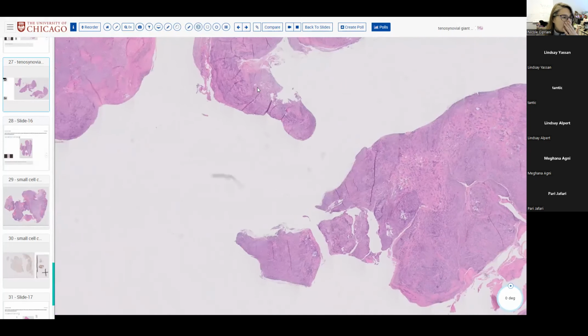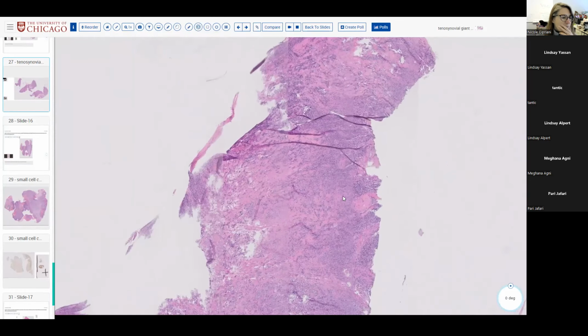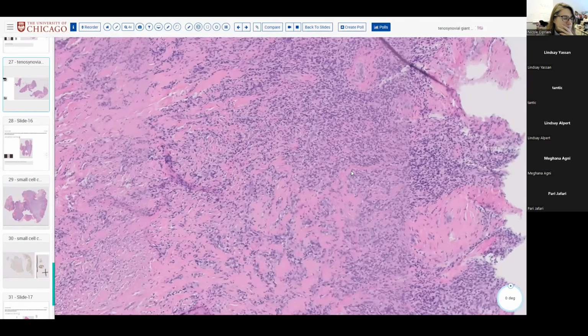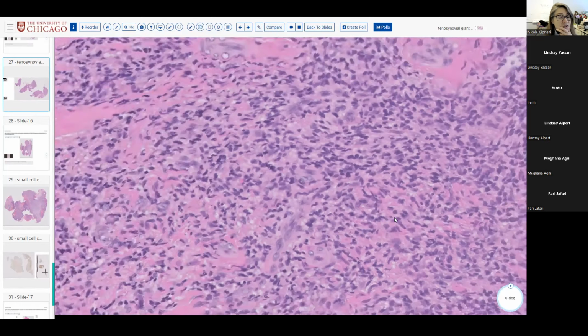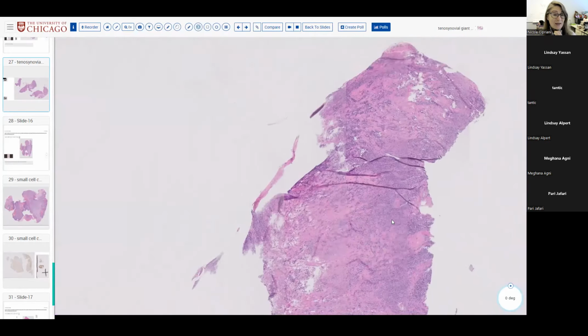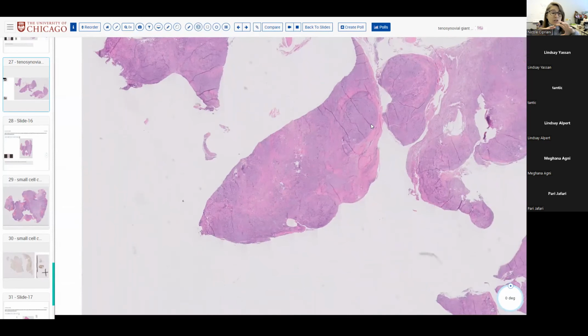A number of you got it right away, and then some said some interesting other malignant diagnoses, which in this case would not have been correct. Tenosynovial giant cell tumors, localized type, are basically a near equivalent to tenosynovial giant cell tumors, diffuse type, which carpet the larger joints and would otherwise be referred to as PVNS. We no longer use PVNS diagnostically, but conceptually it's pigmented, so hemosiderin, villonodular synovitis, meaning it lines the synovium.